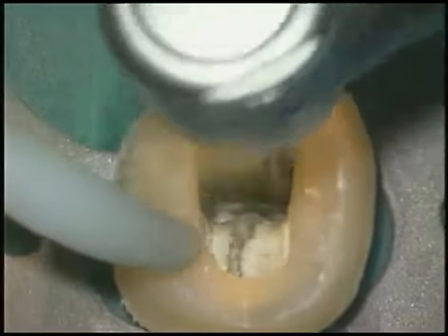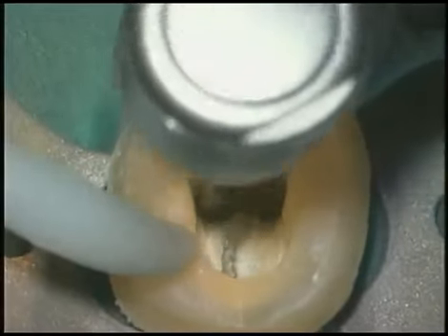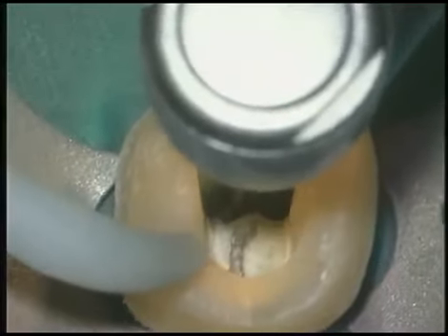Smaller GGs then are used in a crown-down manner. These GGs are tapped very lightly into the canal. I want to emphasize the light pressure that we use the Gates-Gliddens with.